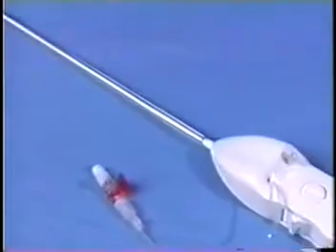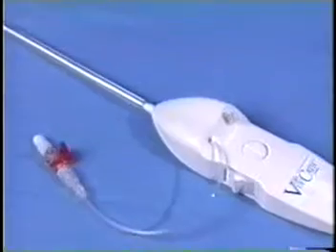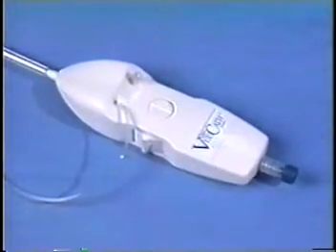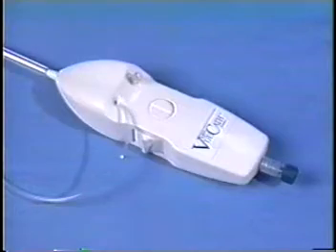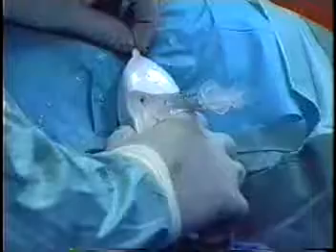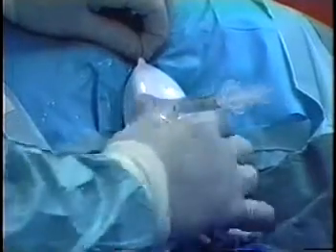The procedure discussed in this video is only one technique for management of chronic low back pain. The physician who performs the procedure is responsible for determining and utilizing the appropriate technique for each individual patient. When used with a fiber optic endoscope, the EBI VUCATH spinal endoscopic system can be used in the lumbar and sacral spine for observing epidural anatomy and pathology, and for the delivery of drugs approved for epidural indications.